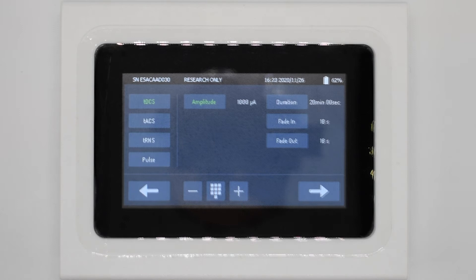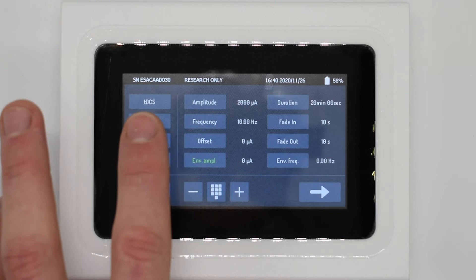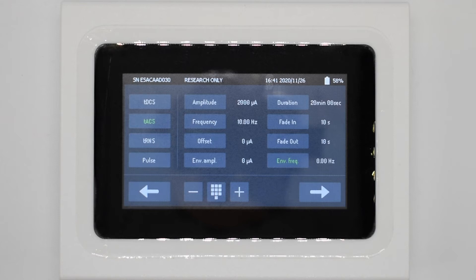Moving on to TACS, we have a few more options. Frequency refers to the sinusoidal signal and how many times per second it repeats. Offset is how far above zero the signal will start. At the bottom we have envelope amplitude and envelope frequency, because the NeuroStim has built-in amplitude-modulated TACS. We define separate carrier and envelope frequencies — carrier frequencies are similar to typical TES signals but modulated by a slower envelope frequency — and we set an envelope amplitude to determine whether the signal will be modulated down to zero.